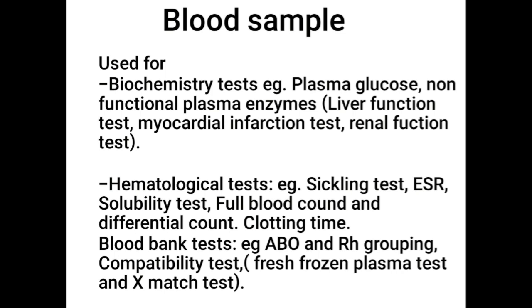Hematological tests: blood can also be used in the hematology lab, where it can be used for sickling test, ESR, which is erythrocyte sedimentation rate, solubility test, full blood count, and differential count.